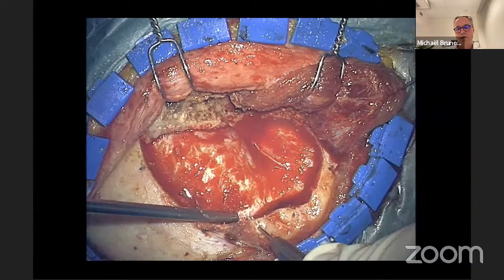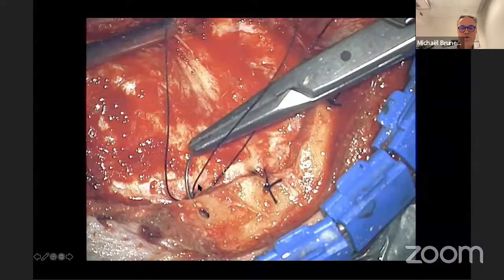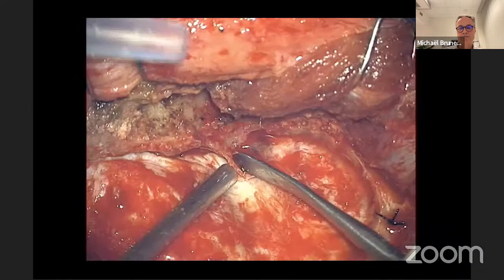Then I make stitches to elevate and fix the dura mater. I usually put a knot directly. In order to allow a perfect and easy closure, you have to place your suture very close to the bone. If you place the suture here, you will have retraction, and it will be very difficult to close the dura at the end.